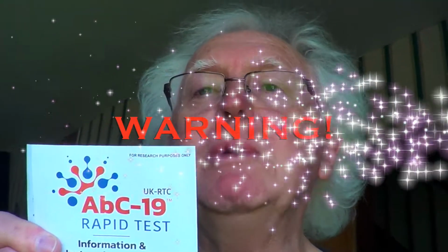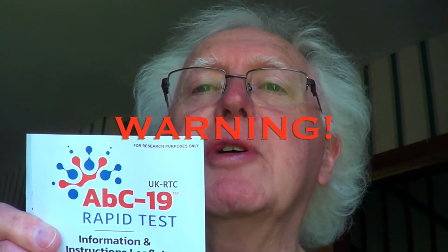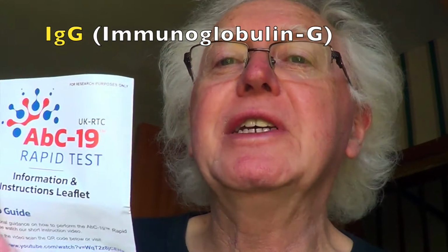Warning, you will see me jabbing my finger and drawing a tiny bit of blood to put into the test kit. So I hope this helps. As I mentioned, it detects the immunoglobulin G, IgG antibodies in the blood. Okay, I hope you enjoy watching how it's done.